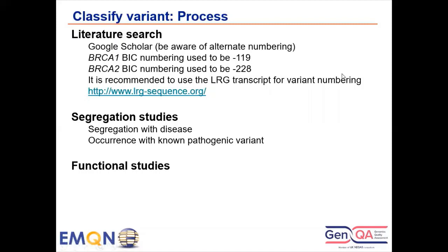Today we have better agreements about that, and it's advised to use the LRG transcripts for variant numbering.